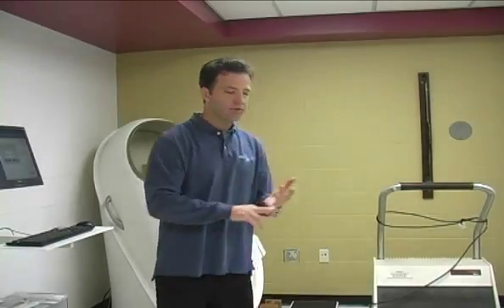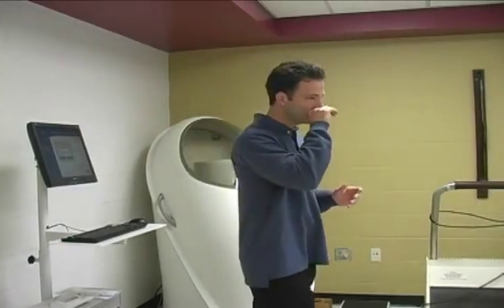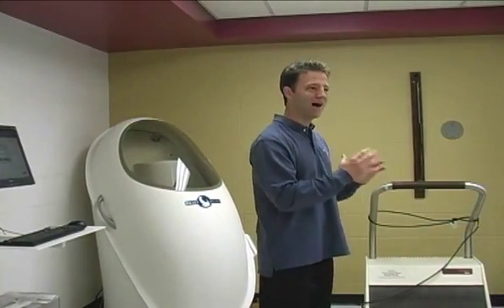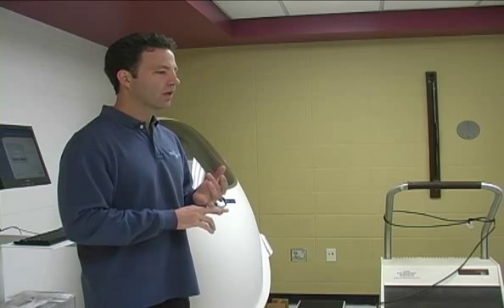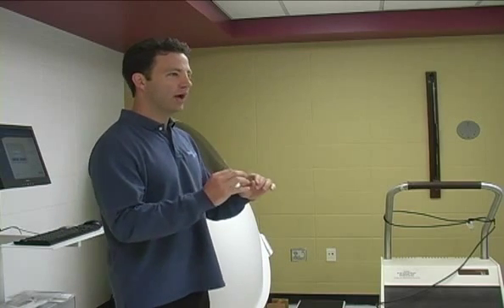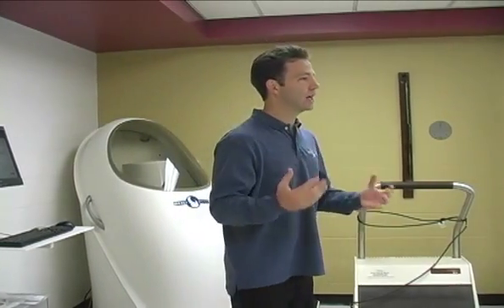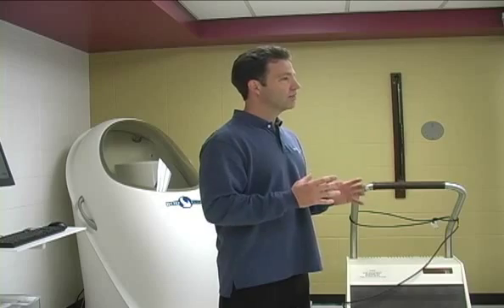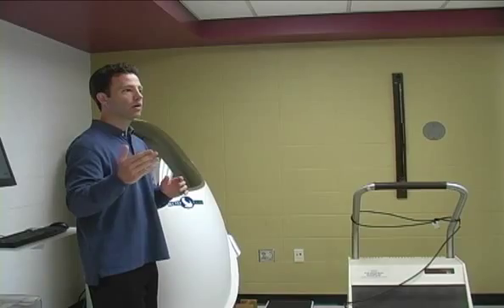Certainly. So if you ask one of the body composition gurus, so that would be Lohman, Dr. Ellis, David Fields, those are the individuals still doing or previously did a lot of body composition research. That was their forte, if you will. To a person, to a man, they'll indicate that the most accurate way outside of autopsy to assess body composition is a multi-compartment model. Multi-compartment model is where you're able to break the body into 4 or more sections.